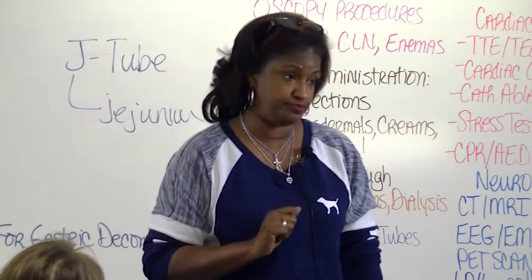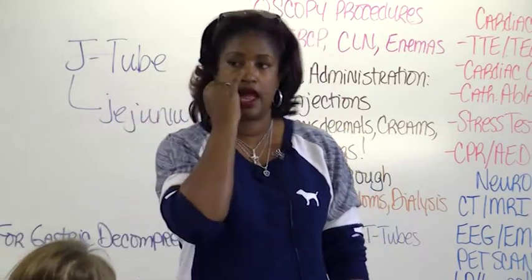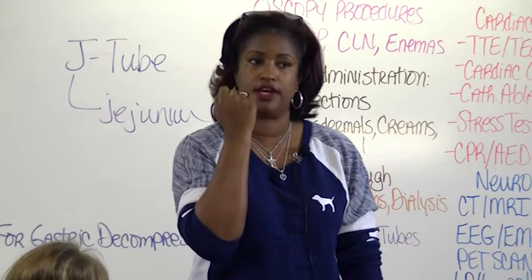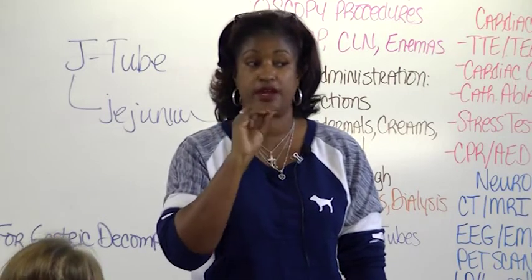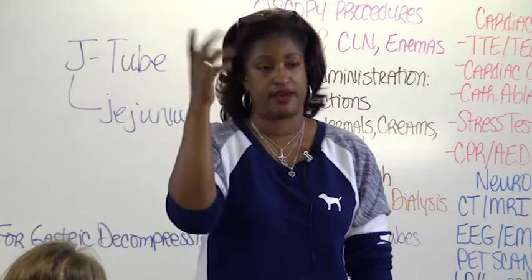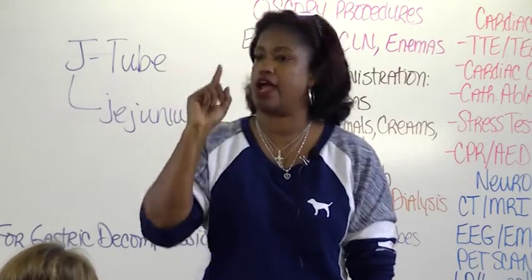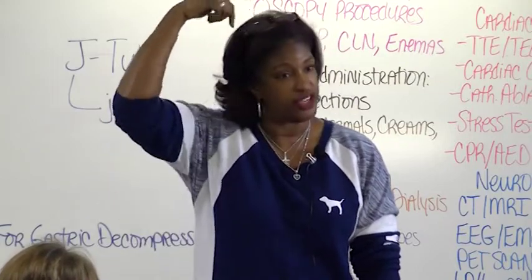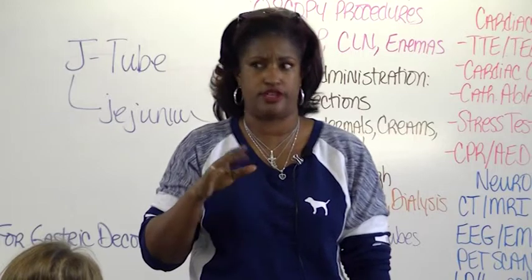This is what you better know. I told you this in endocrine. If you take your little bitty finger and you put it in your nose, which you cannot do, but if you could, and you keep going, what are you going to hit? Pituitary. That's what happens with a TBI, a traumatic brain injury. You put that injury in, it's going to keep on going to the brain, because you have a fractured skull. You have an injury, and now you have an NG coiled. I will never forget the CAT scan picture. It's a coiled NG. If you Google image, you'll see it. Because it's not the first time a nurse has done that.